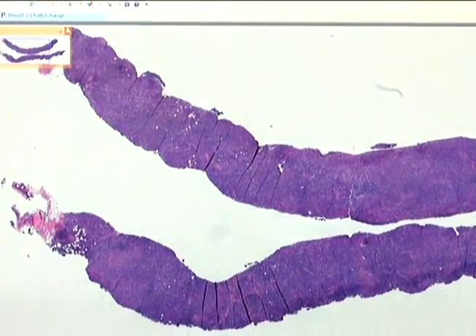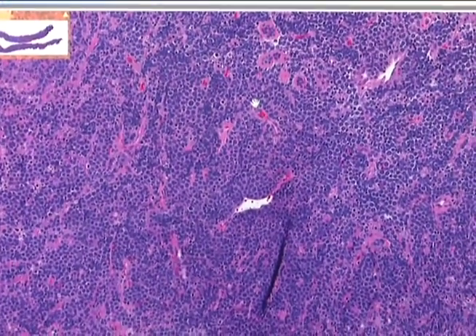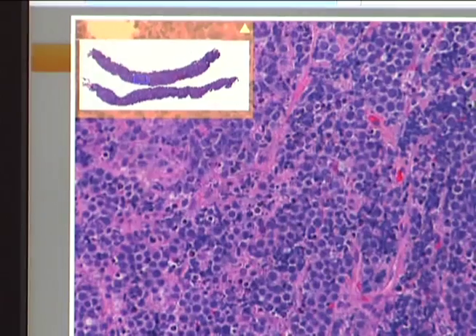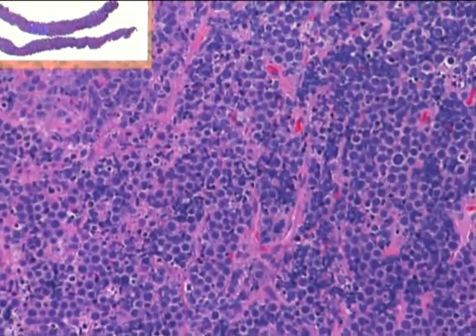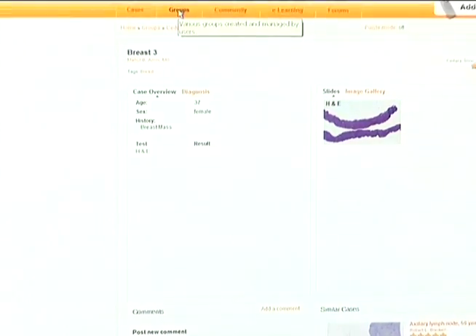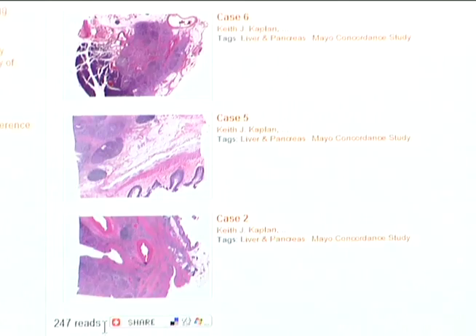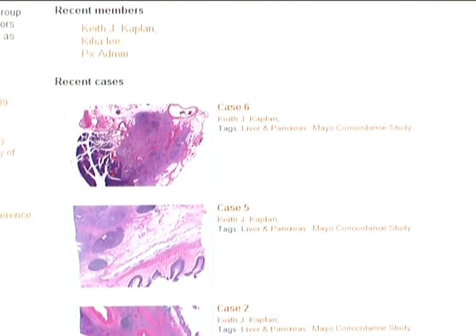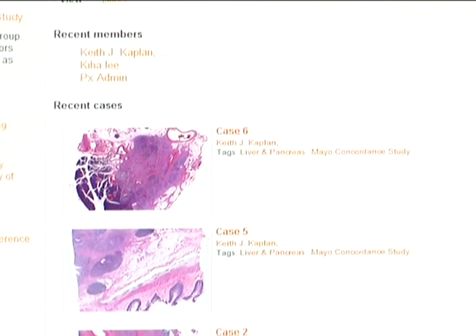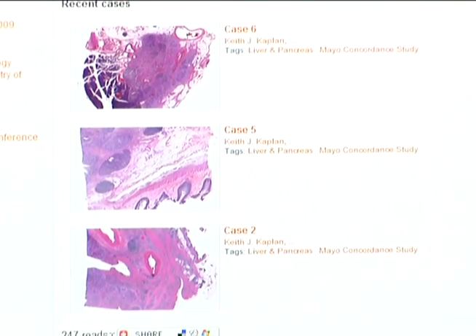Selecting a given case will then bring the viewer into a screen where the virtual slides can be brought up for further review. Within the PathExchange community are essentially the tools — the virtual microscopic tools — to be able to view whole slide images, which is really the most powerful application of PathExchange: the ability to go into cases and review them as you would a case on a microscope.